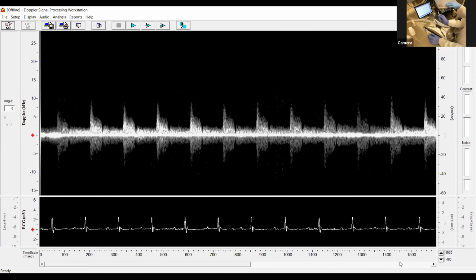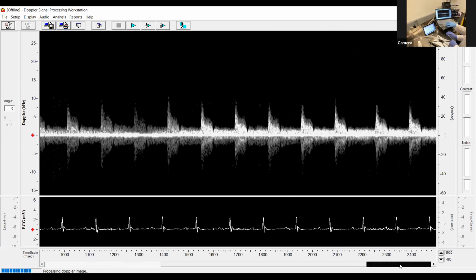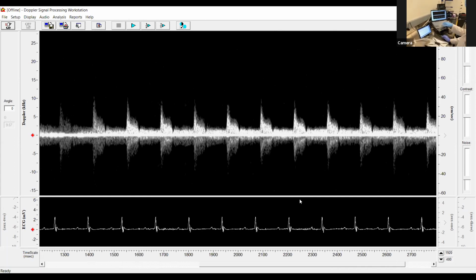You're good. So if we click down here, we see a very strong signal coming up during systole, and then through diastole, we do have consistent flow. Measurements can be made at different velocities in terms of peak and lower velocities, and the system would give you measurements of resistive and pulsatility indices. So I think at this point we had planned to do pulse wave velocity.